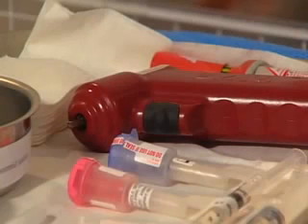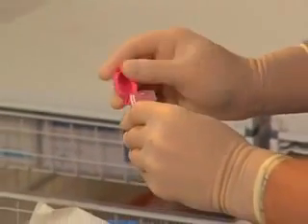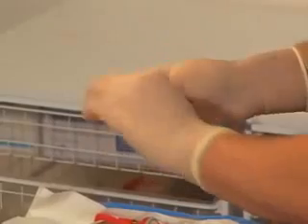Select the appropriate needle size based on the patient's weight. The pediatric needle is designed for use in children weighing less than 40 kilograms, unless large amounts of overlying soft tissue predict the need for a longer needle.